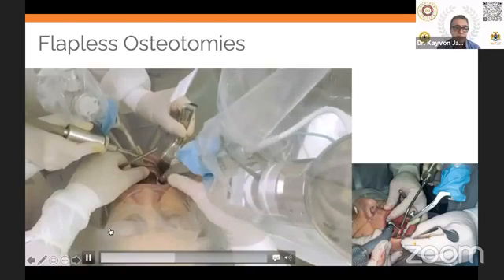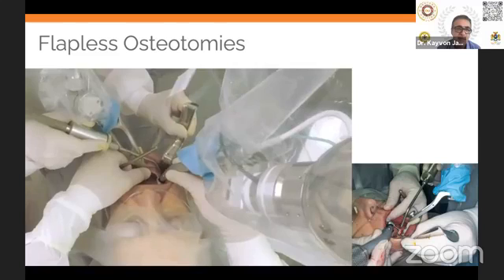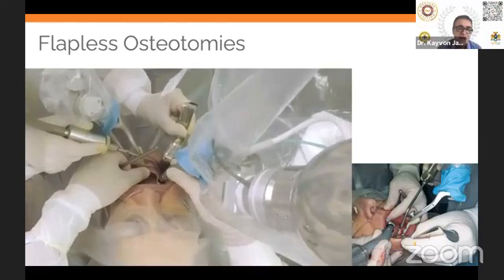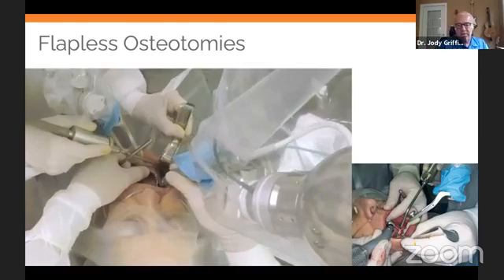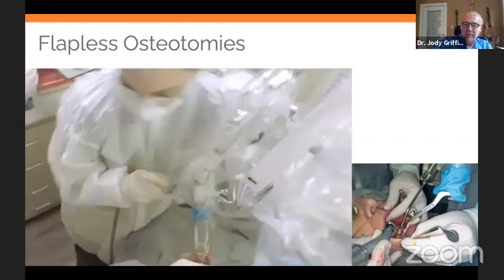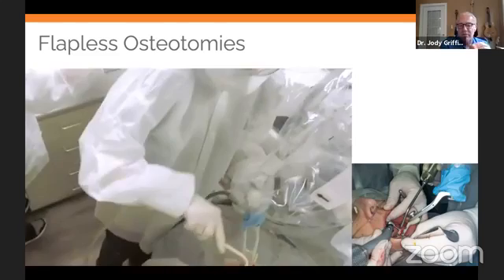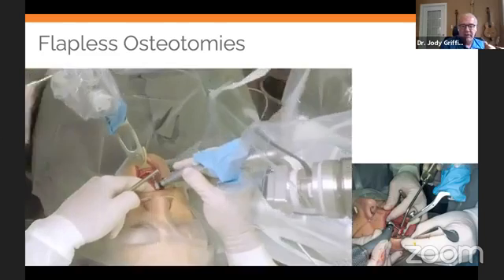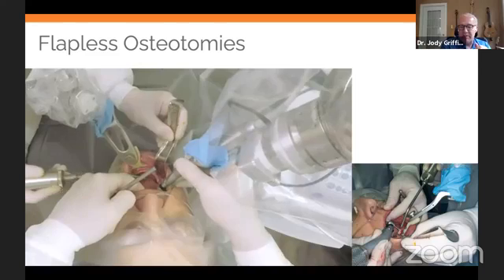Dr. Griffin, since there's no audio, let me ask you a question here. When you take the CT with the initial guide, when you screwed it, how do you ensure that that guide sits back in the same place when you're doing the surgery? Great question. There's actually a landmark check. You place the landmark navigation crosshairs on top of one of those bone screws, and then you place the tip of your burr onto the screw head, and it will calibrate to make sure, and you verify that you're in the right position.